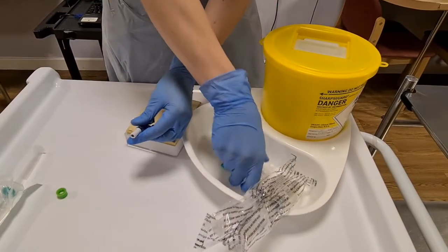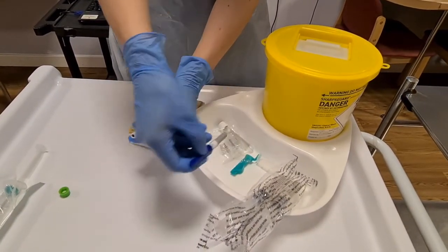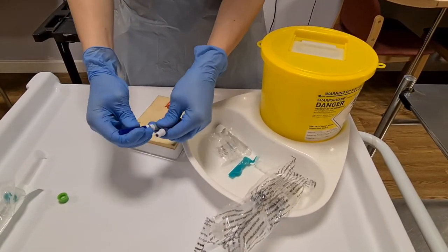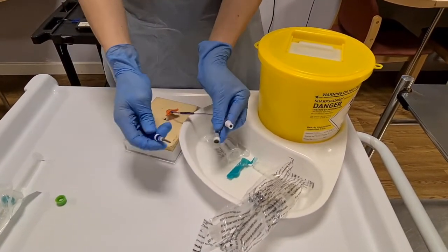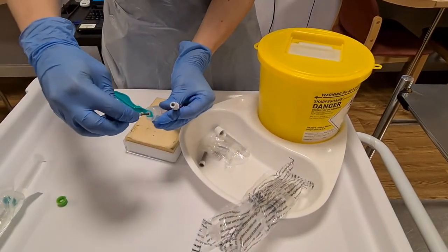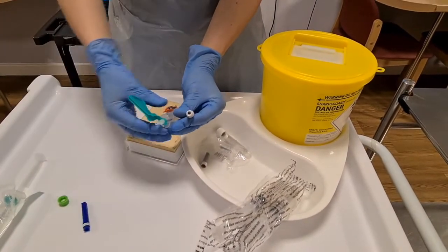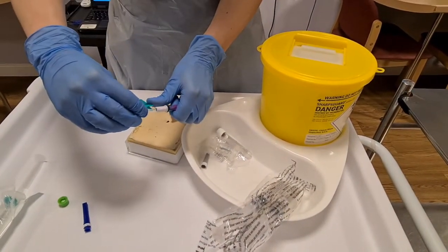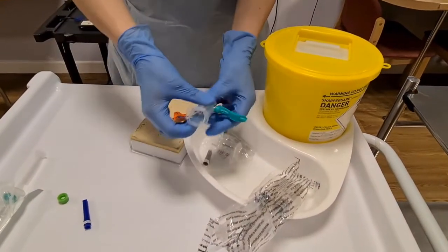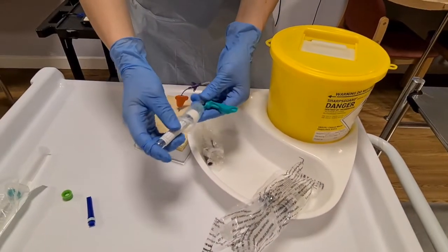You add on either a Vacutainer, or the blue one. So it's not the green, the blue. So you add this on, placing this in, twist it on, remove the dark blue, press it on and connect like so. And then you can take as much blood as you require.